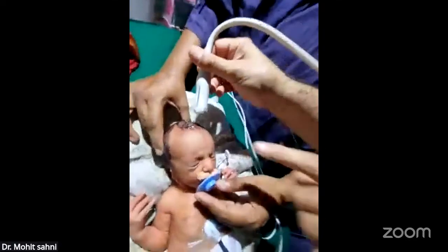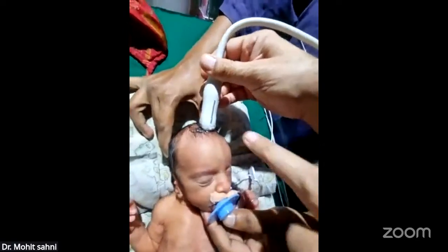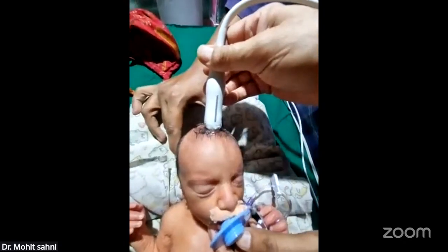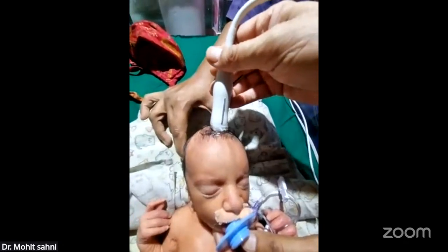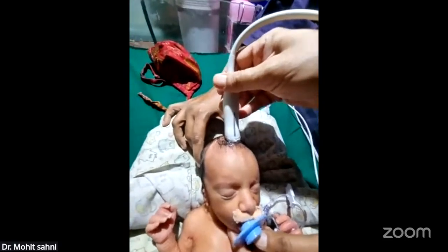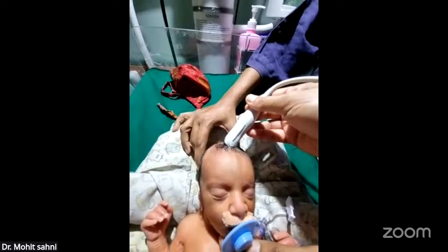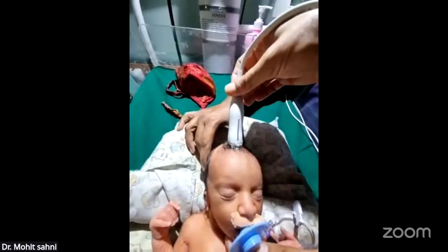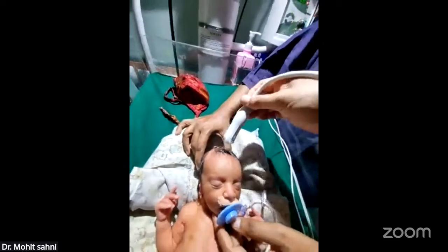So for sagittal views: in coronal sections the pointer was pointing at the right side, that is 9 o'clock. Now we will rotate the pointer, and now the pointer is pointing at 6 o'clock. So this is left side sweep and right side sweep. We start with the mid sagittal in the middle, and then we can go for left parasagittal, right parasagittal, and this is right periventricular. You have to sweep more on the right side, and then for left periventricular, you have to sweep more on the left side like this. So these are the sagittal views.